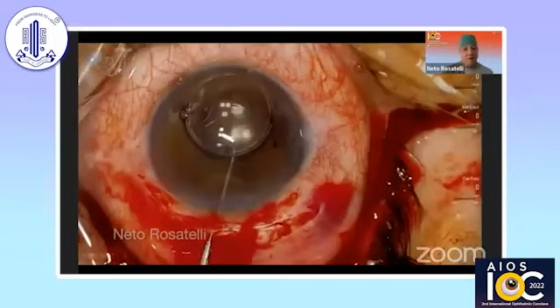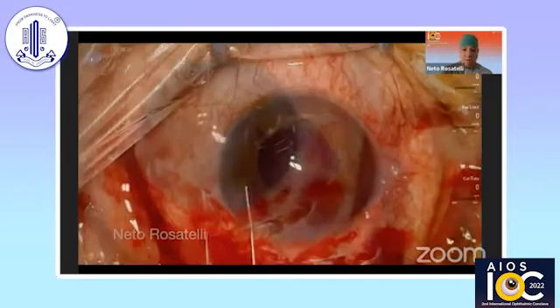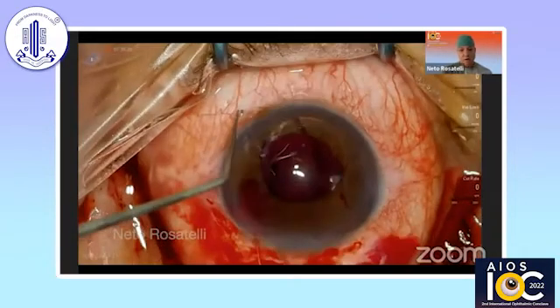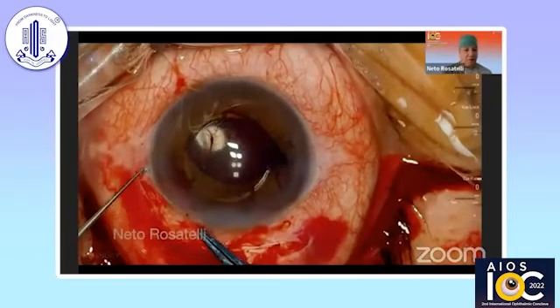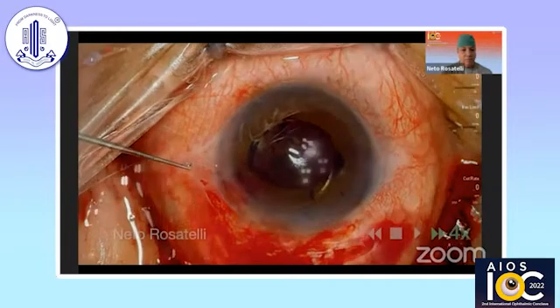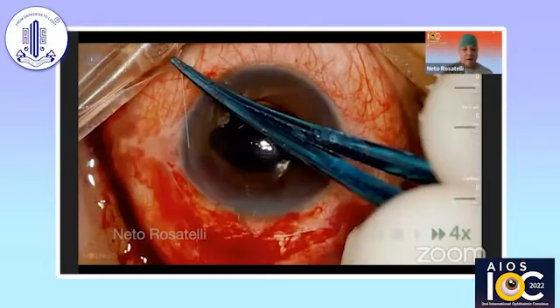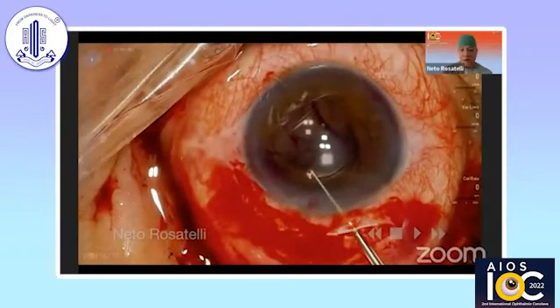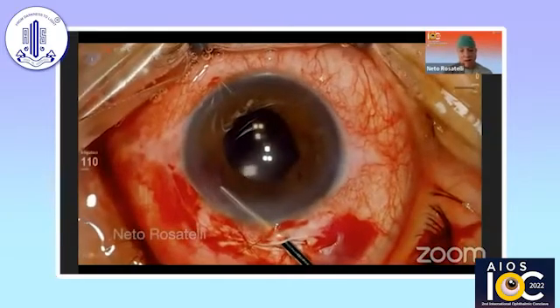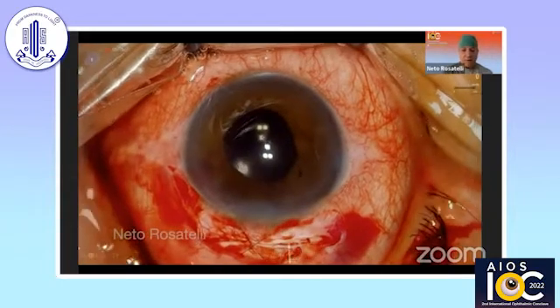The other side is done then, and after putting the second haptic in the sulcus, the needle is passed in a similar fashion, and the other haptic is then tied. Suture ends are retrieved through the other side port. The suture is tied, and the IOL is completely fixated to the iris with the haptic in the sulcus. The IOL is then repositioned back, the anterior chamber is cleaned of OVD, and the surgery is completed.